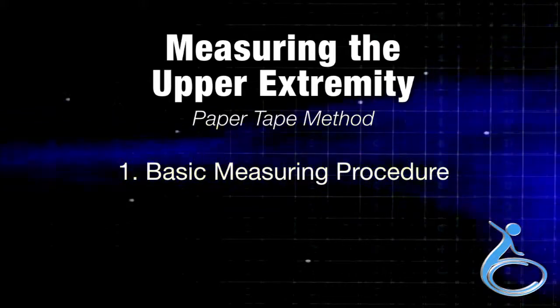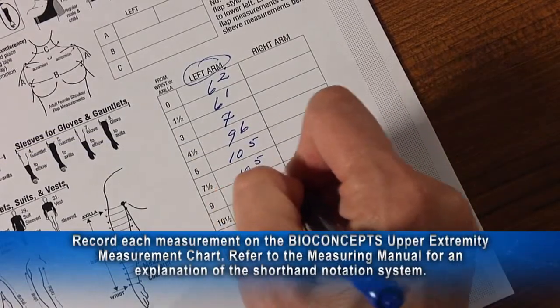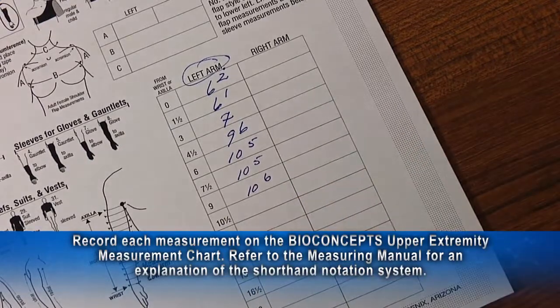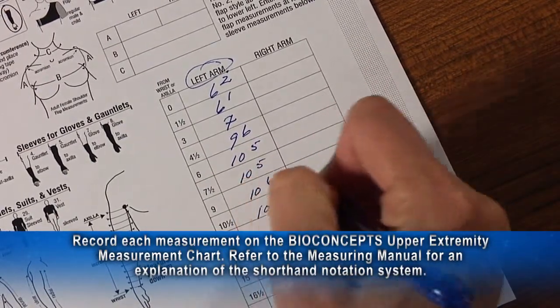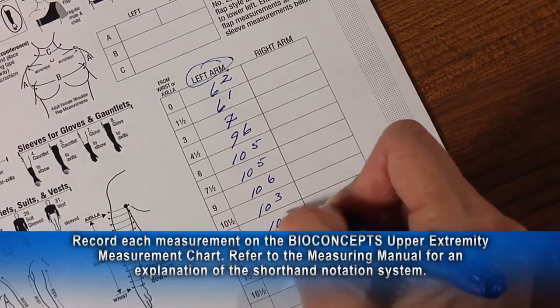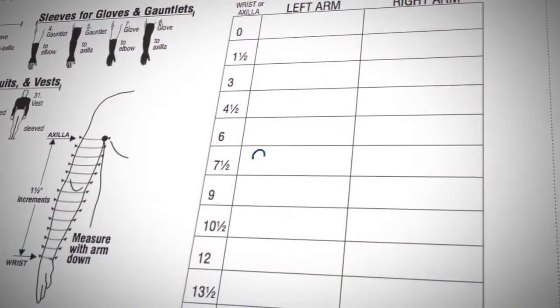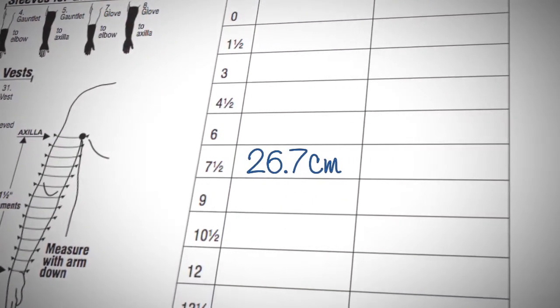Section 1 is the basic measuring procedure. Record each measurement on the BioConcept's upper extremity measurement chart. Refer to the measuring manual for an explanation of the shorthand notation system for measurements recorded in inches. Measurements in centimeters are welcome — simply record in decimal notation.